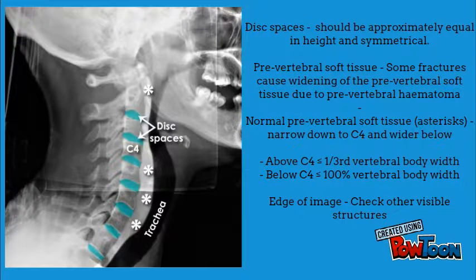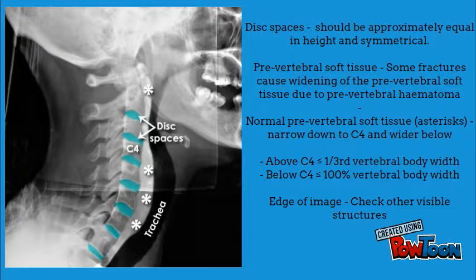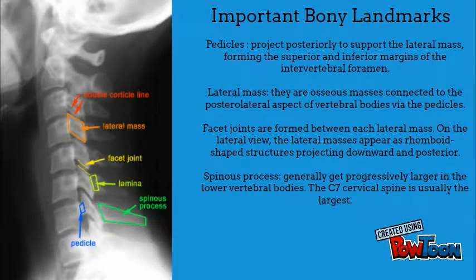The disc spaces should be approximately equal in height and symmetrical. Inspect the pre-vertebral soft tissue — some fractures cause widening of the pre-vertebral soft tissue due to hematoma. Important bony landmarks are the pedicles, lateral masses, facet joints, and spinous processes.